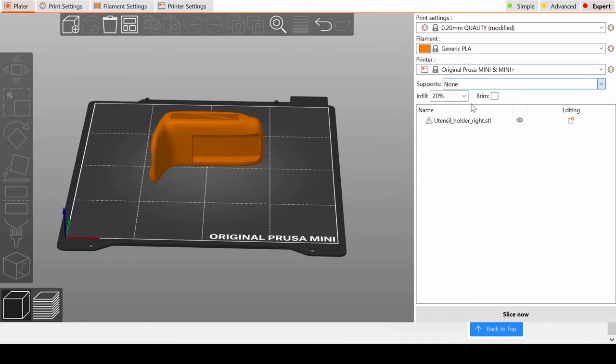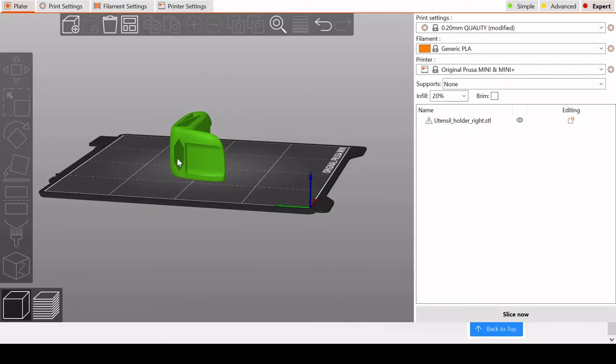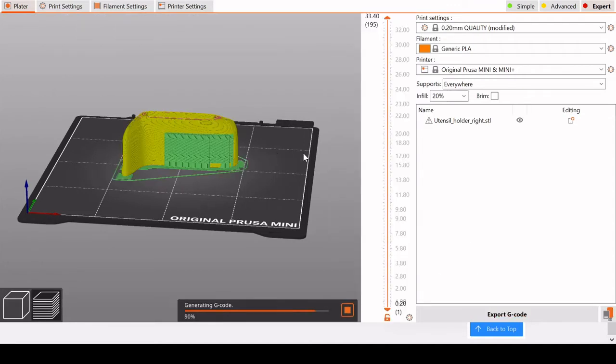The final major consideration that you'll want to take into account is supports. Supports help to support areas that have overhang that could otherwise droop or mess up your print. With 3D printers, you're working against gravity, so having a base to support on will sometimes help. Changing the orientation of the print on your print bed can change where the supports are required and potentially make your prints quicker and use less material.